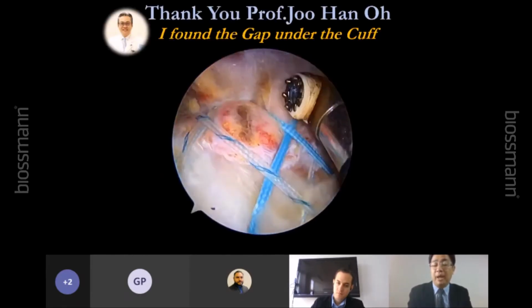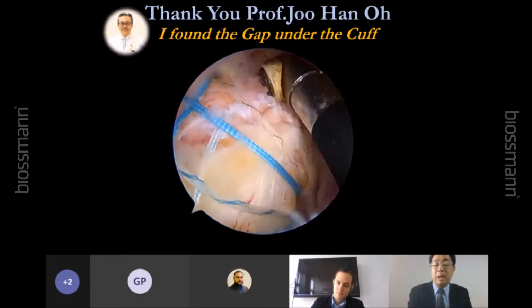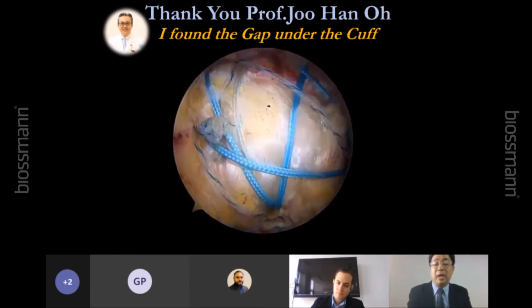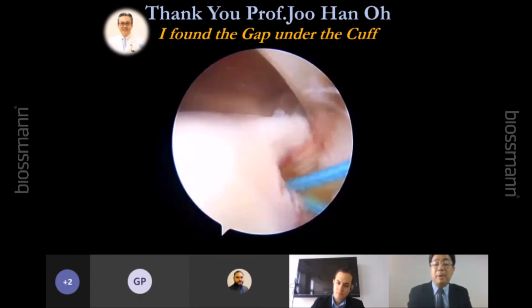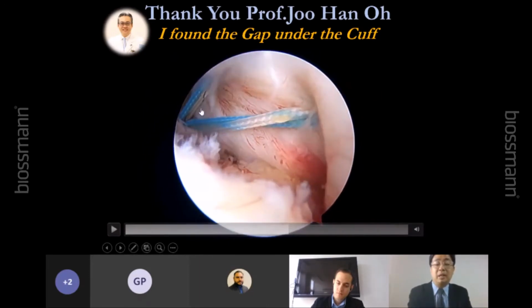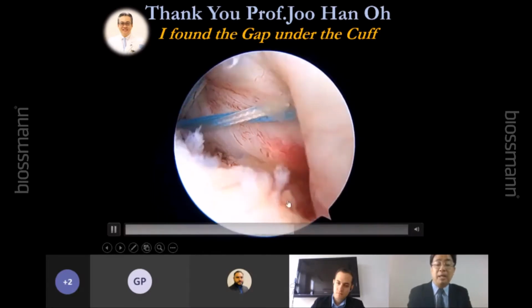I believe him, and then with this patient, I put the camera in. You see that after the knotless suture bridge technique, it looks nice, right? But when I put the camera into the joint, I'm surprised. Oh my God. Okay, you see that? There's a gap underneath.